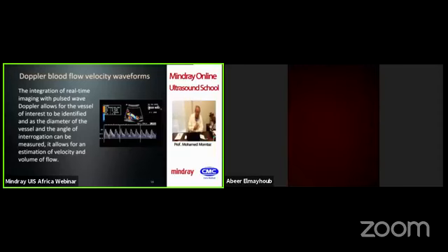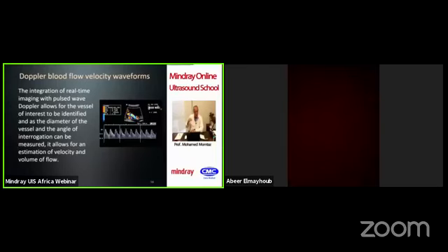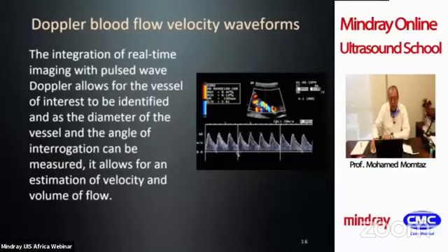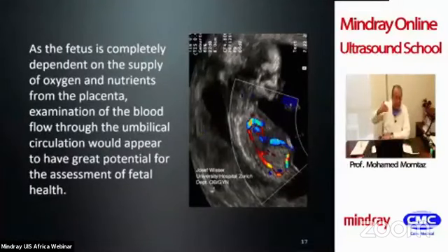With advancing gestation, the placenta gets bigger and the vessels there get less resistance. So the diastolic flow in relation to the systolic flow increases with pregnancy, and the baby with advancing gestation will have lower resistance, with lower indices.